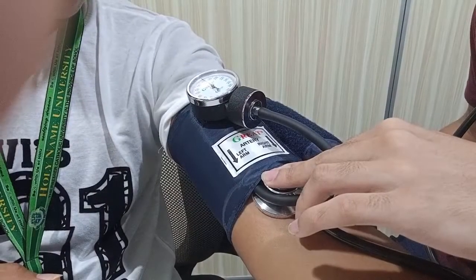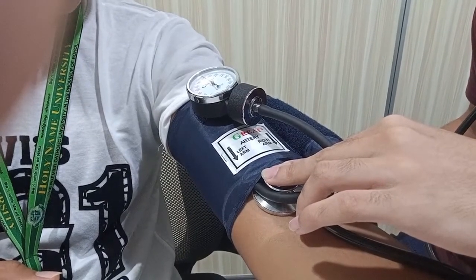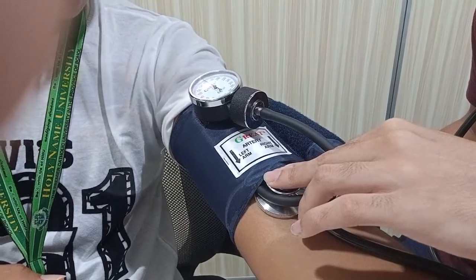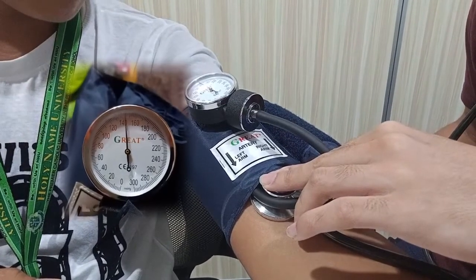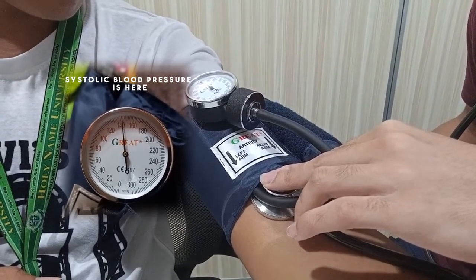Sixth, listen carefully for the first pulse beat. As soon as you hear it, note the reading on the gauge. This reading is your systolic pressure, the force of the blood against the artery walls as your heart beats.